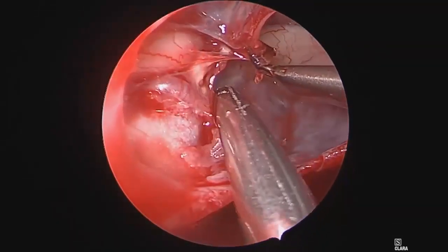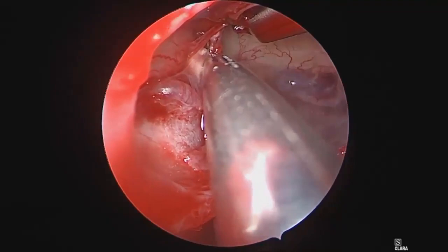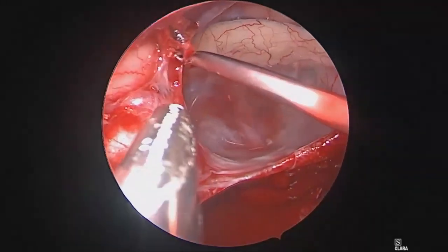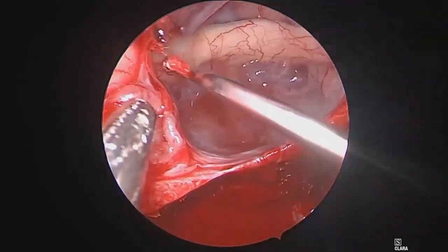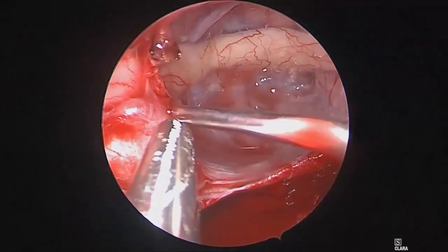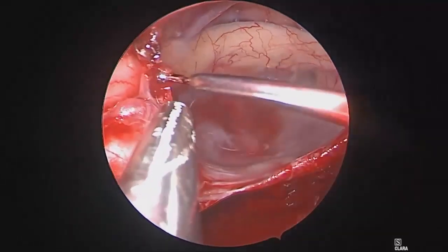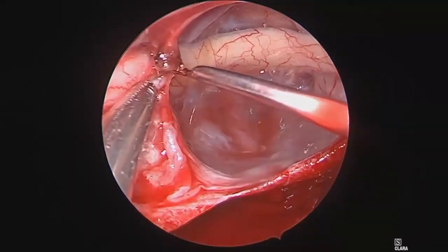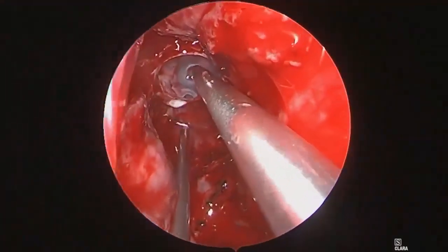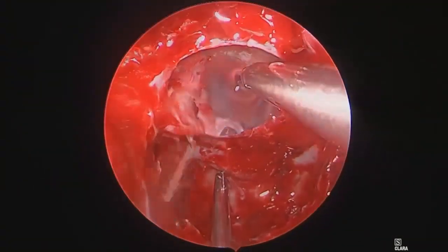Upon further inspection with the endoscope, we can identify small implants again in that thin veil of arachnoid. Blunt instrumentation is also used to deliver these small areas of residual disease and aspirate them for a complete resection. As you can see, dermoids have a tendency to recur because of residual disease like this.